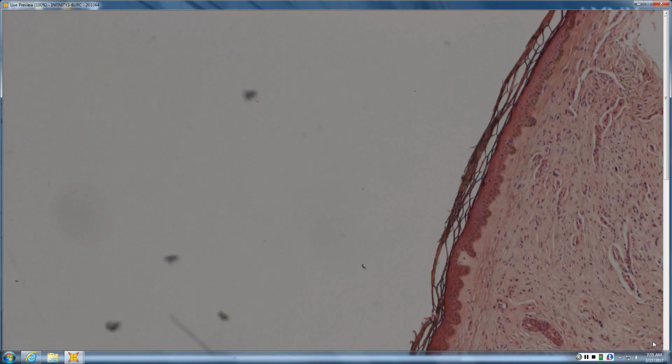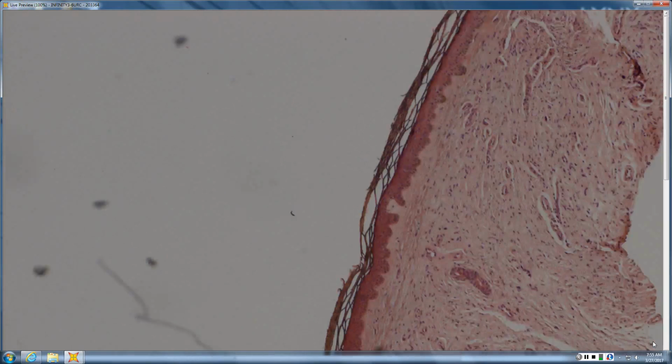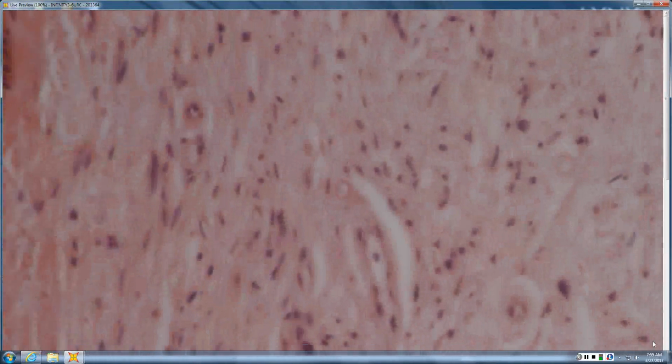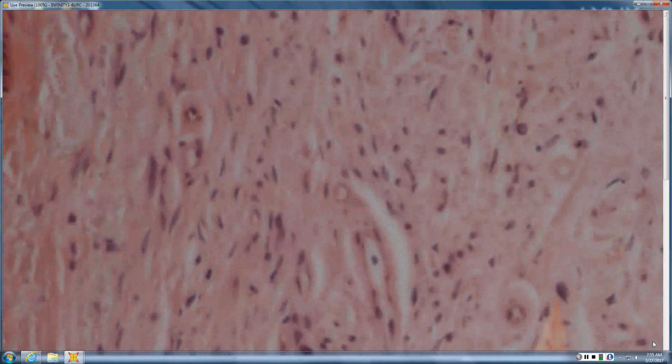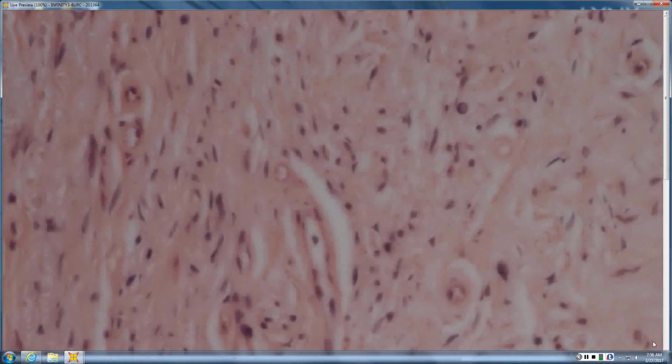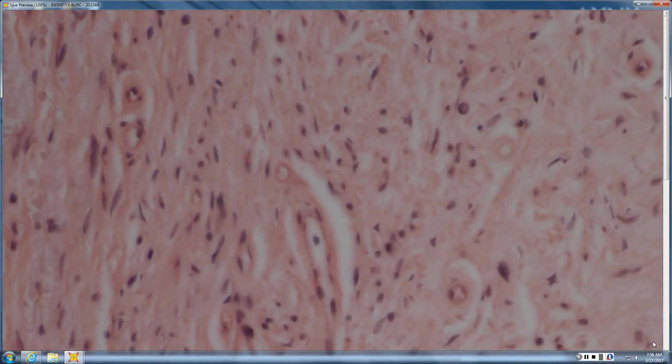Looks like the top of a neurofibroma, kind of diffuse, myxoid, jumping dolphins. But I'm going higher. There are some pretty large, dark cells. Some of them stellate, atypical. They look almost like radiation fibroblasts. Wouldn't that make this malignant? I don't see any mitosis in there that would be potential for malignancy.